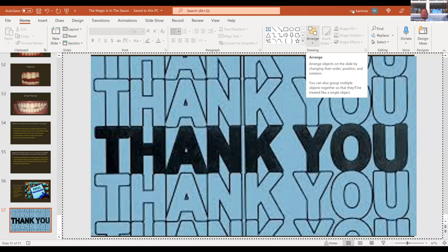I love doing this tag team. So what do you think? If dentists want to do a selective etch, I really believe you need a viscous etch, Pete, because openly it's a controlled etching. So people who don't want to etch dentin, only enamel, I love both companies' viscous etch. The other aspect that Ron just mentioned: we surgically suction first before rinsing. So we'll surgically suction, then the assistant uses a larger suction, and then we just rinse. But openly, I prefer guided etching rather than just running etching.